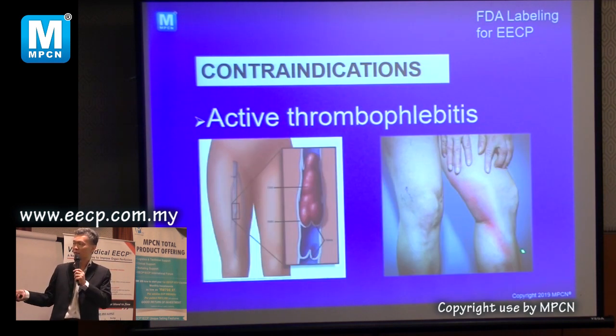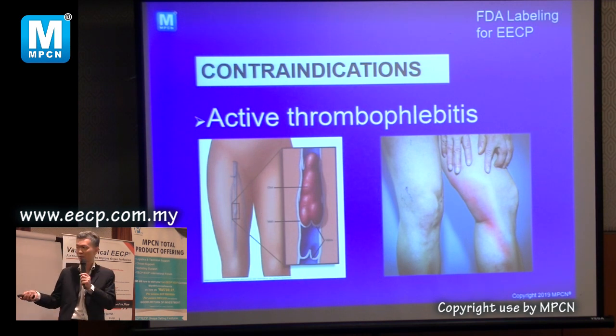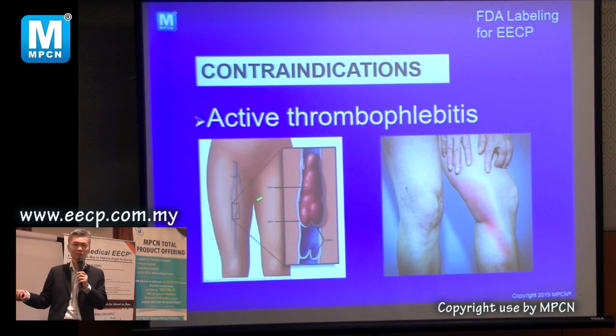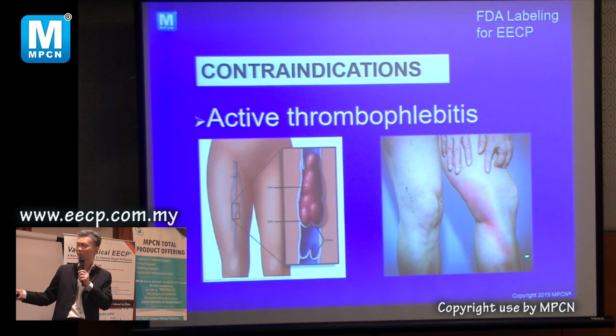And then if you have cellulitis or a blood clot in the superficial vein, it is also a contraindication, because if you have a blood clot there and you squeeze it, where does it go? It goes to your lung and can cause death also. So you watch out for this. You check the legs, make sure they are not inflamed. If it's inflamed, either infection or this is a contraindication, because if it's infection, you squeeze, the infection will spread, and they will say your machine caused that.